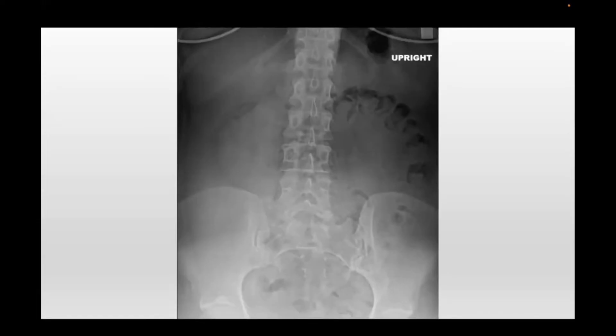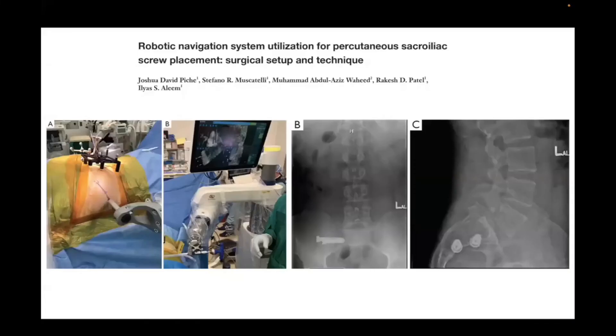Always beware — this is actually one of my patients I was getting ready to operate on at the surgery center with just fluoroscopy, no navigation. Sure enough, I missed a Bertolotti or transitional anatomy, visible on the AP view on the left side. Those procedures are still doable with fluoro — you just need some modification of technique and to really stay below that alar line. But better off, if you know beforehand — following the technique described by Dr. Patel and his team for either navigation or robotic navigation. This is one where robotics and navigation was used with a particular robotic system that allows live navigation as well. A very nicely written paper — highly recommended.